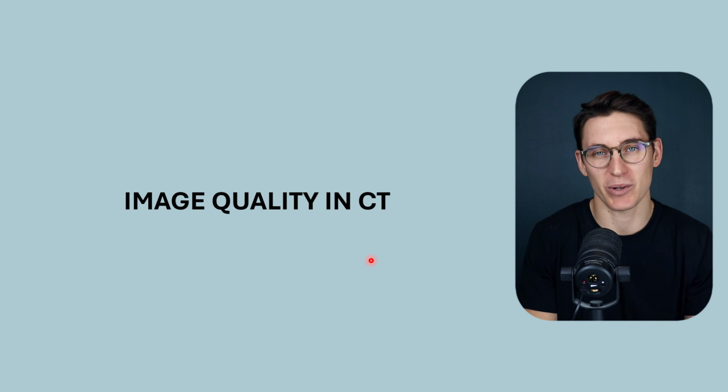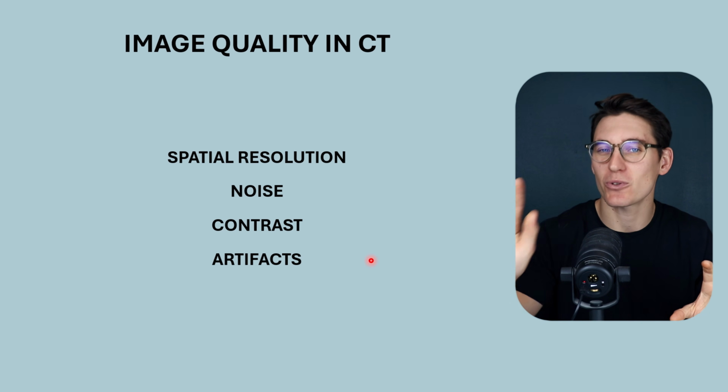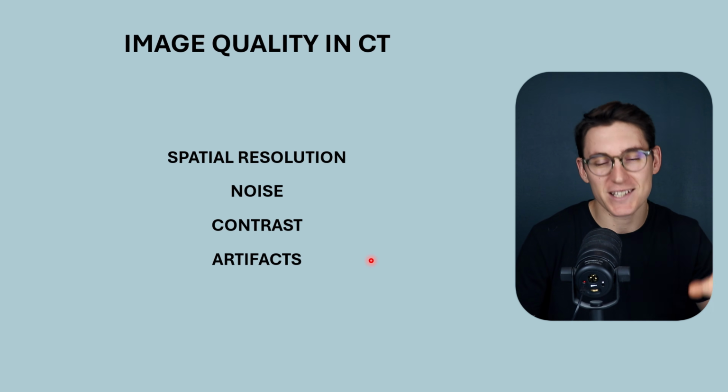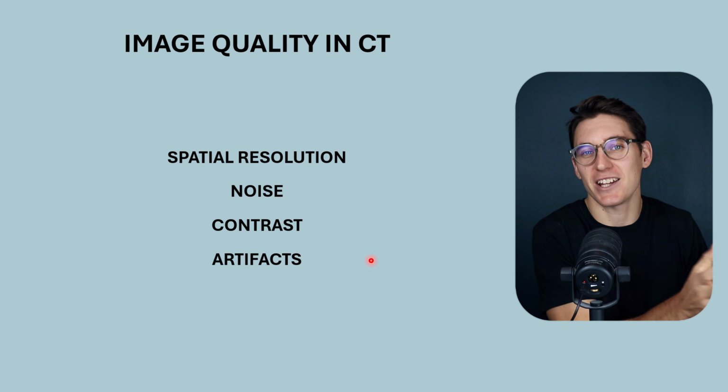Let's talk today about image quality in CT. Now whenever we're trying to determine the quality of an image, we can assess four separate categories. We can look at the spatial resolution of an image, the noise in that image, the contrast resolution in that image, as well as if there are any artifacts or not.